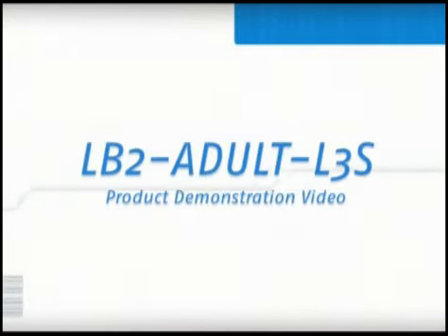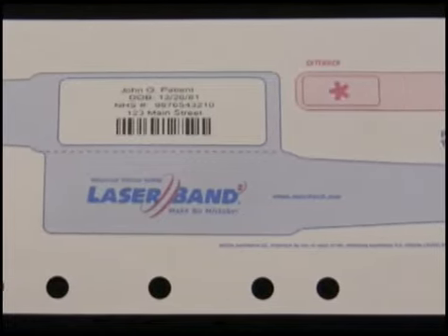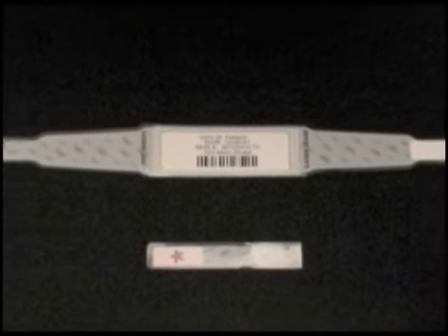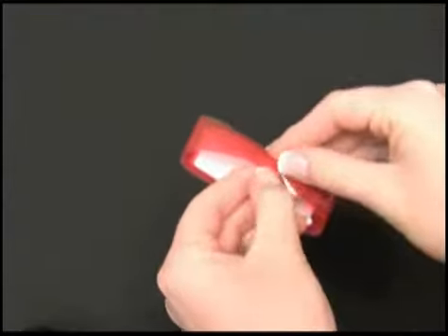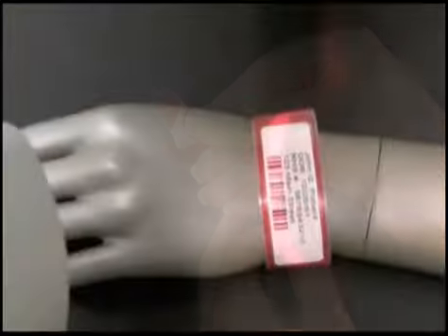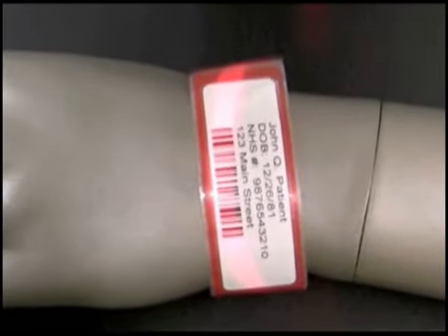The following is the product assembly demonstration for the LB2 Adult L3S, which is available in a variety of colors and includes an adult wristband and a wristband extender. The LB2 Adult L3S wristband's straightforward fastening method eliminates user confusion, and the integrated tamper-evident wristband tabs increase patient safety. The clear laminate and ultra-white image area lies extremely flat for superior comfort and ease of scanning.